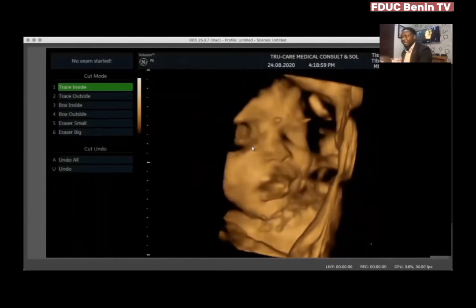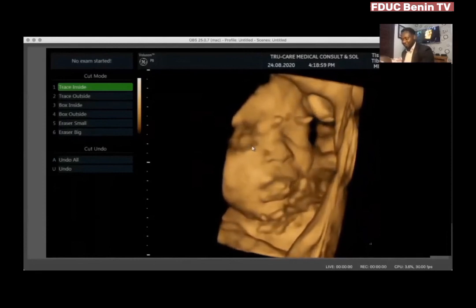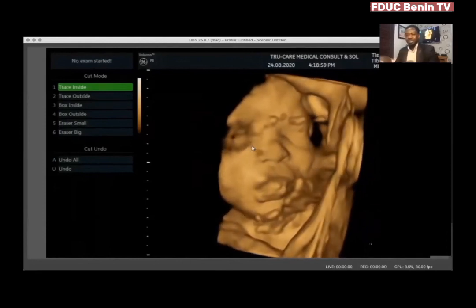I believe that maybe when we have more time, we'll be able to spend more time scanning. Dr. Higa, over to you. I don't know if we've done what we need to do concerning the demonstration yet. You have done, don't worry, you have done more than what one would have even asked for within such a very short time.